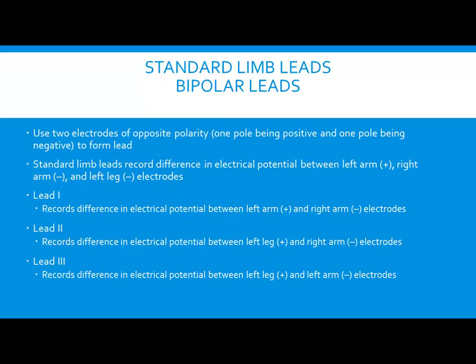All right. So these again are your limb leads. Pay no attention to these right now. And then you've got your green, or your right leg. So our bipolar leads, the recording that we're going to get off of this monitor, is going to be based off of my right arm, my left arm, my right leg, and my left leg limb lead.